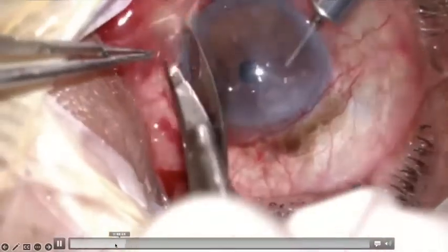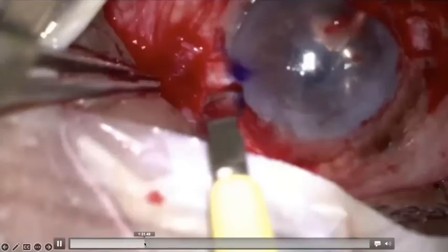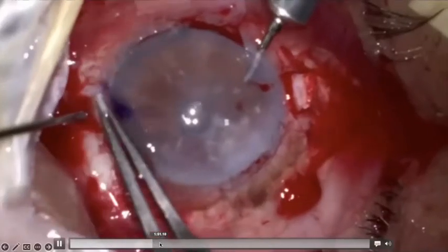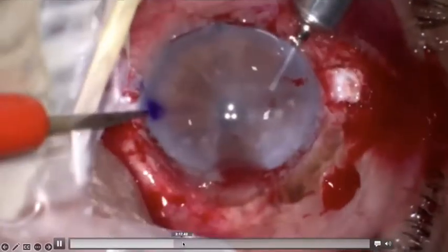So here you can see that I notice that there's no intraocular lens there. So many of the details may not be visible on slit lamp. And so now we have to shift our strategy and change to a glued intraocular lens. And many times we do advise the patient that on table there will be certain decisions taken which will change the strategy of operating and the surgeries that are required.